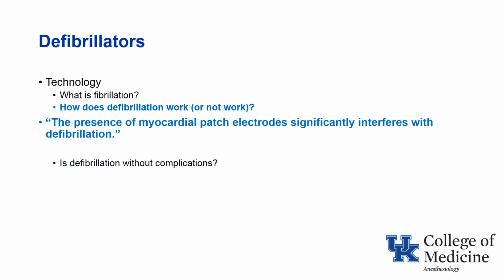Now, this statement here refers to the presence of external, or not external. This refers to the attachment of patch electrodes to the epicardium of the heart, as it used to be performed before transvenous AICDs were invented.